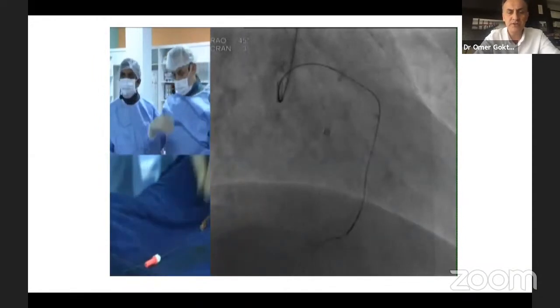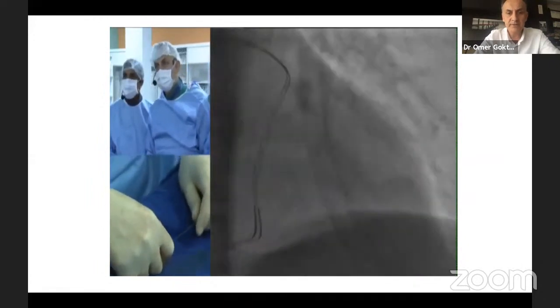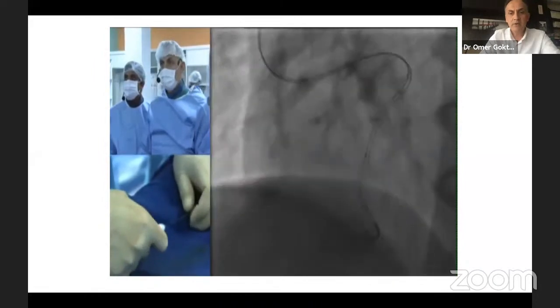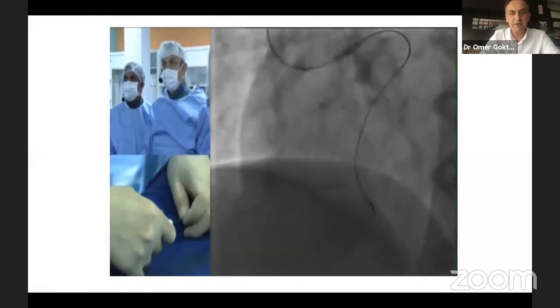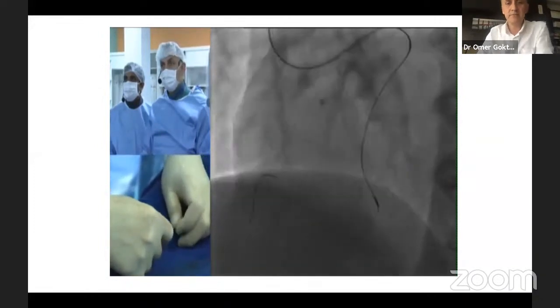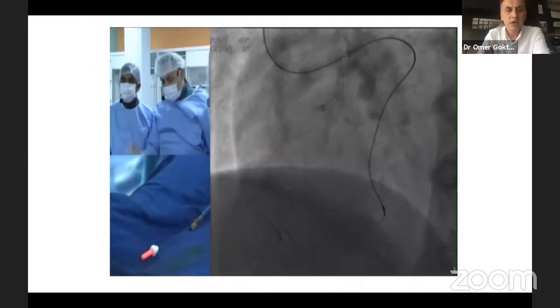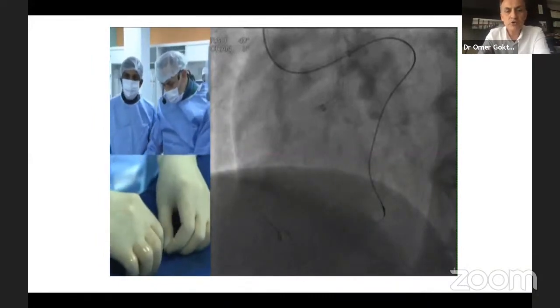And we are pushing the microcatheter. It's easy to push. This is a Corsair catheter, the classical one. Now we go back to another view to see better and more easily. Now we are distal in the RCA, and of course we have to insert our microcatheter now. Look how we do it. We torque with the right hand and we push with the left hand.